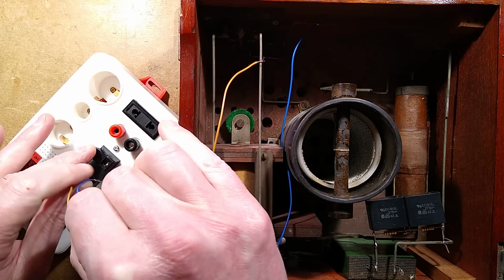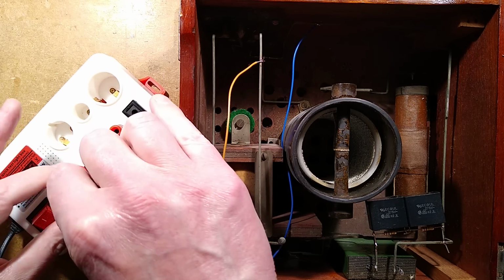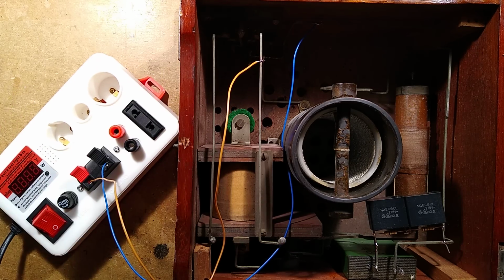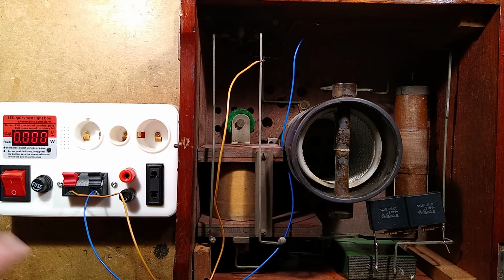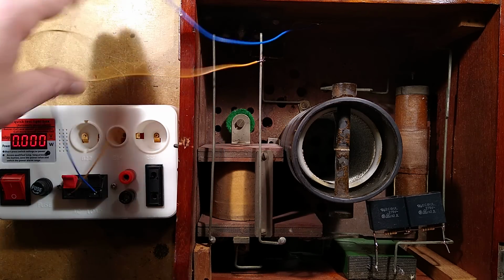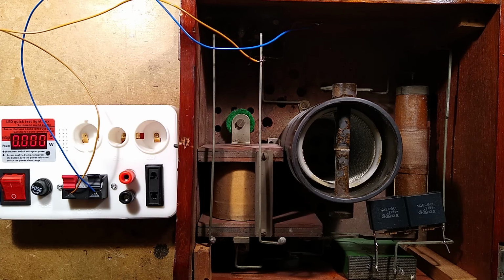So I'm going to stuff that wire in there, power it up but not turn it on straight away. And I'm going to power it on and we can see the power it uses. So at the moment it's displaying about 245 volts. Let's get this wiring away from the high voltage zappy sparky bits. And I shall set the knob to about there and then turn it on.